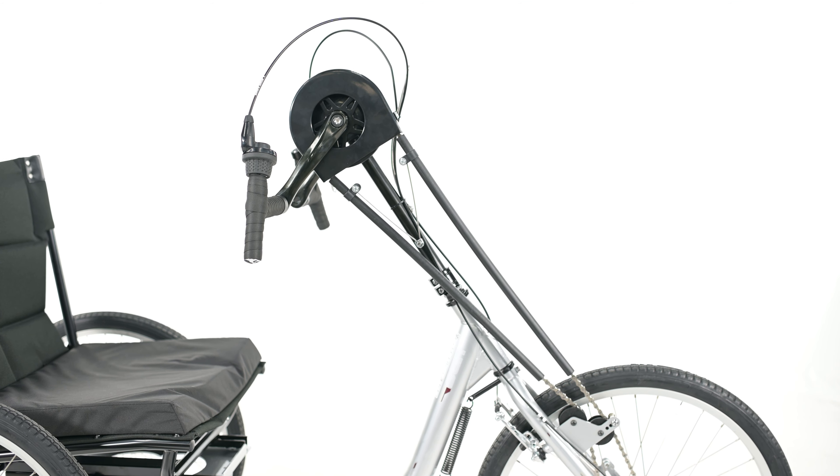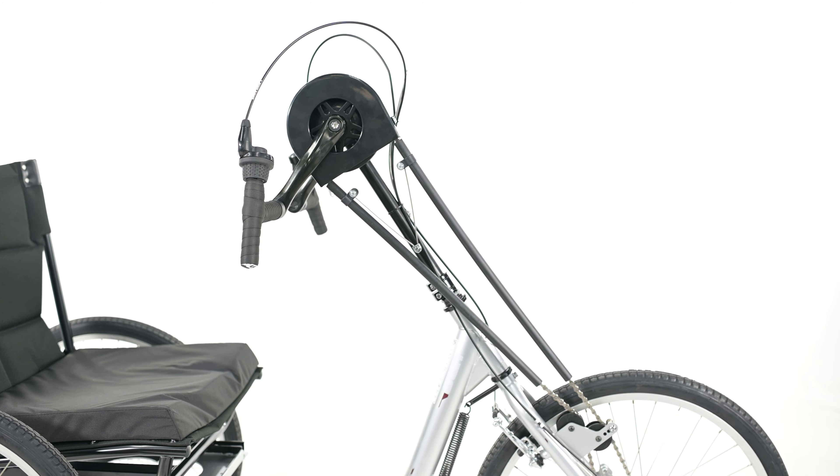The crank height on the HT3 is adjustable and can be moved up or down depending on the rider's height. Keep in mind that if you do need to raise or lower the cranks, you'll need to adjust the chain length accordingly.